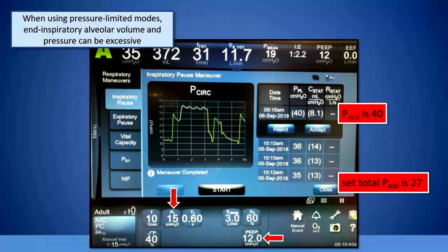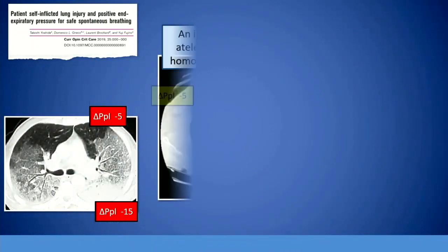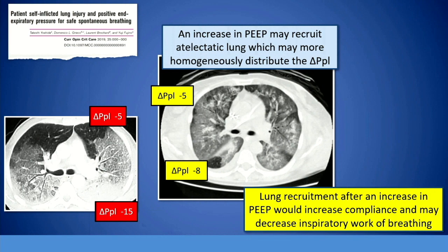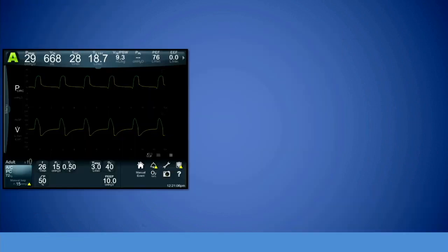Even if you're using pressure control ventilation, it doesn't mean that you're capping their alveolar pressure, because in PC ventilation, you set the airway pressure. You never control alveolar pressure. So just back away from that idea right now. And so you get this idea where if I want the lung to be more homogeneous, I have to increase the PEEP and open that up. That is one idea as we go forward: pay attention to vigorous inspiration because it means something, and just think of where that gas is going.